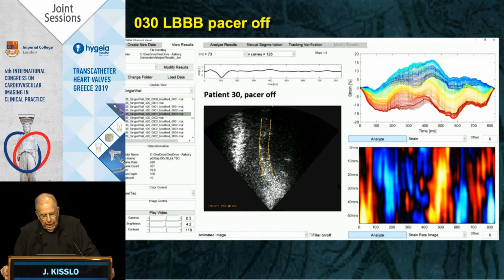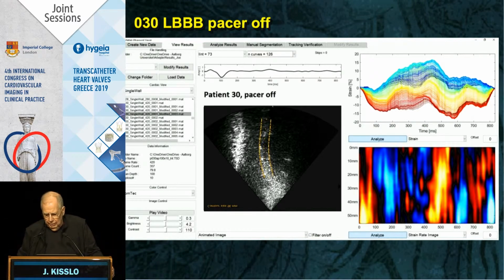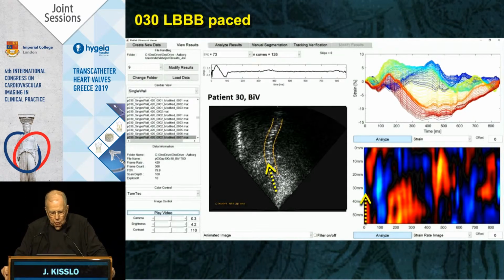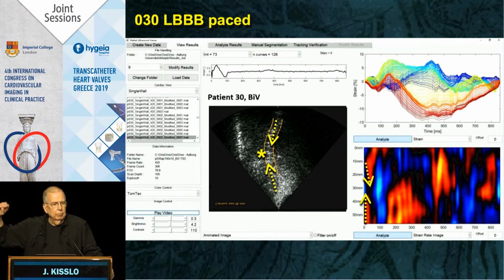Here's a similar kind of imaging. Here, you see the crazy curves. But when we turn the pacemaker off, we see the waves come up. We don't know why it's coming up with the pacemaker turned off. And here, when we turn the pacemaker on, we see some very strange phenomenon. We see the collision of waves, not only coming from the AV node down, but from the pacemaker up. We have no idea what's happening. But what this says is we'll see new things.